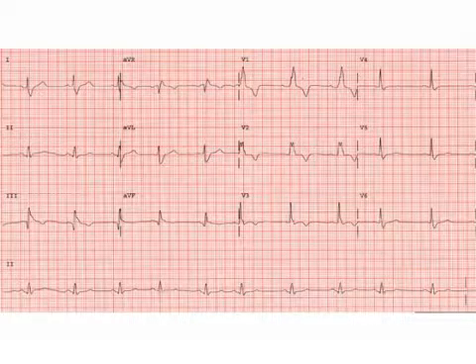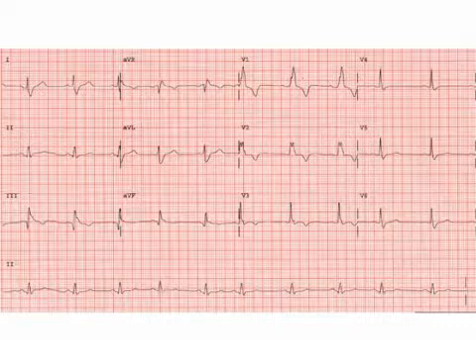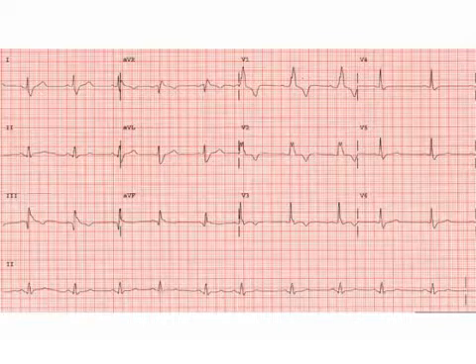For the next two rhythms, I think we'll look at some pattern recognition. And here we'll look at the entire 12 lead. We have a couple of examples, and here, really what I would like you to focus on is the QRS interval. You'll notice that it is wider than 3 small boxes, and you'll also notice that it has a pattern, the so-called rabbit ears, especially if you look in the appropriate leads.